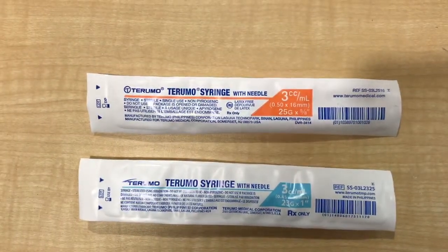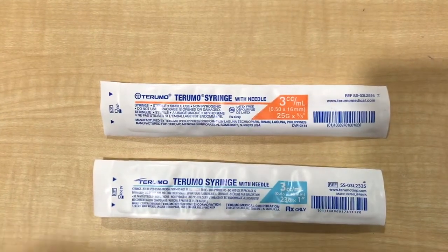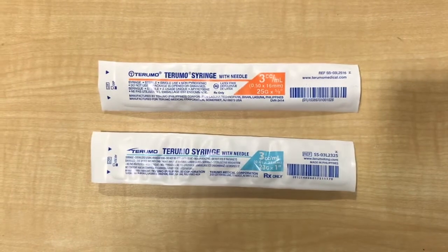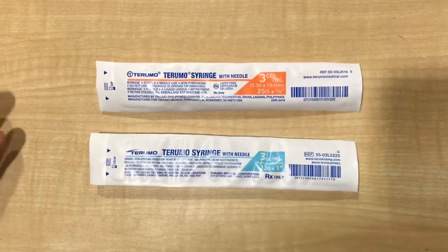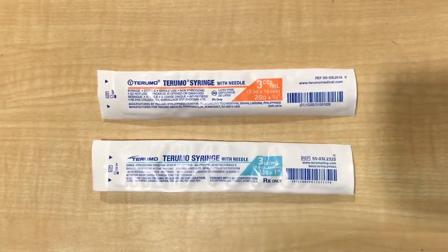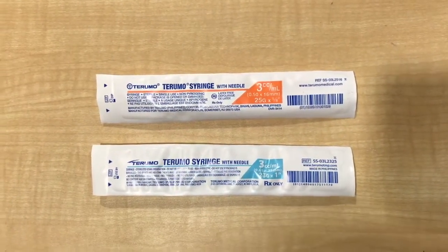It's also important to note that the larger the gauge is, the smaller the lumen of the needle is going to be. I have assessed the patient's weight and body size, and it is appropriate for their age and gender. So that's why we are going to be using these needles today. If we had an obese patient, then we would want to give them maybe a longer needle just so that it gets through their adipose tissue.